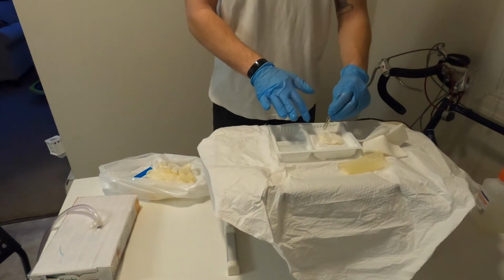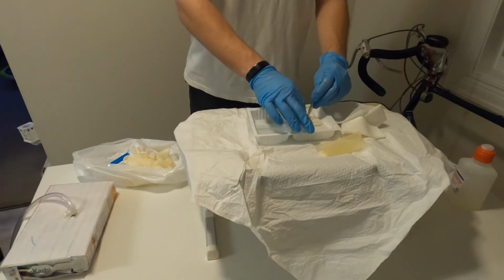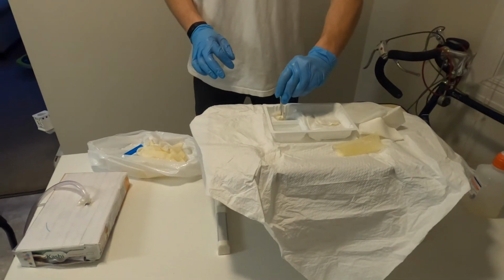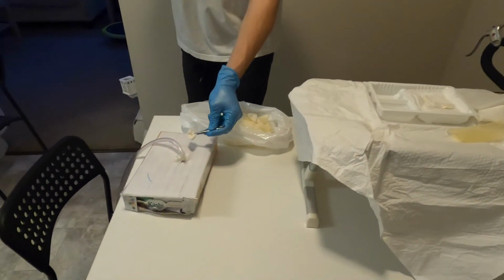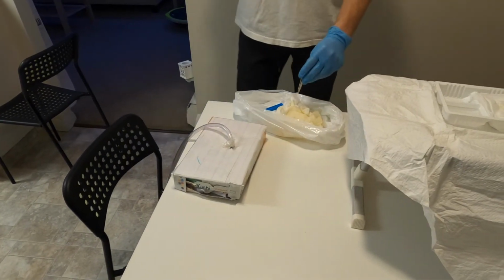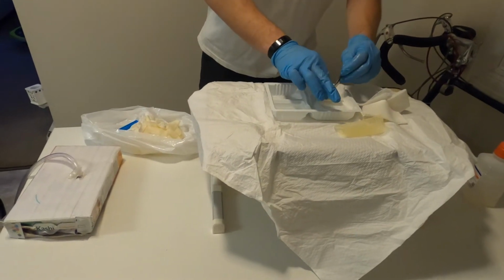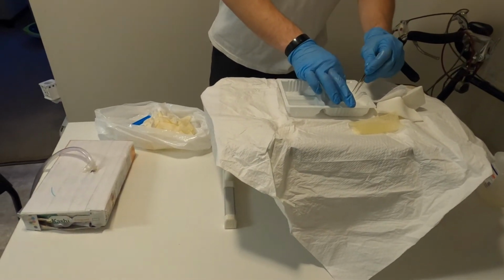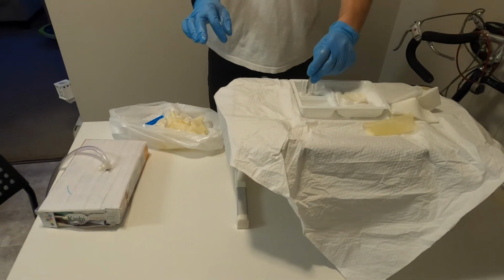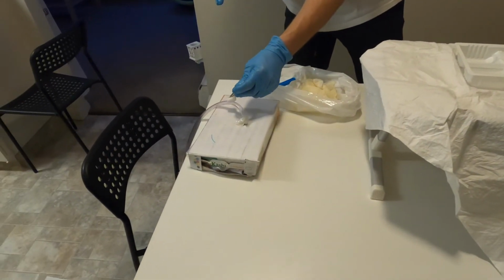And now I'm just going to clean the chest tube. Same idea with the rosettes. So here I'm just going to do one swipe underneath. From the side of incision layer away. One last one here, and then I'm going to dry everything. So now we're going to go on top here.